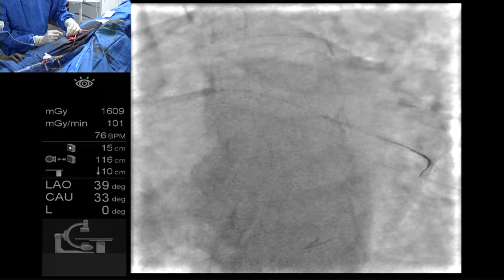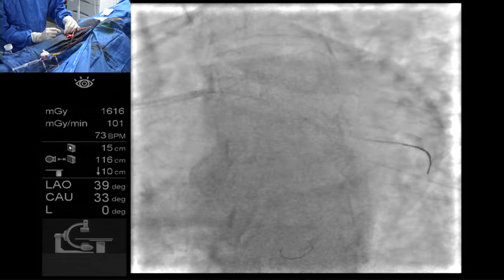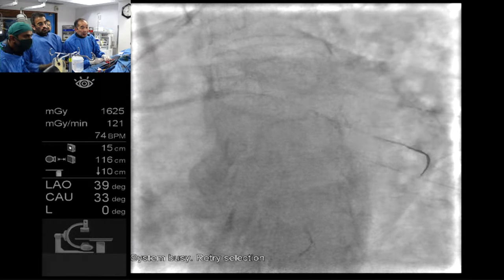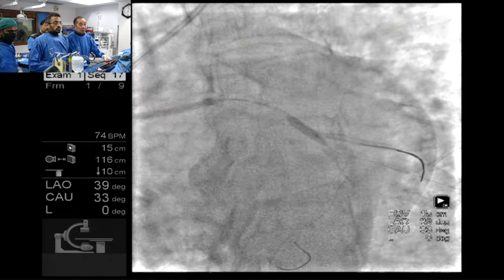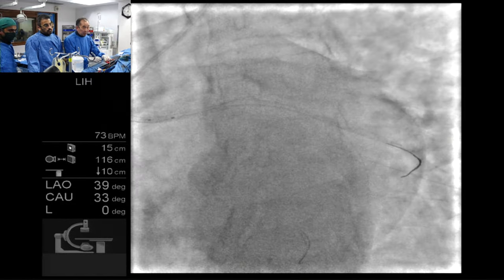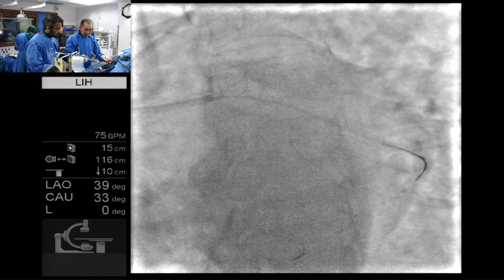Okay, can you just do here one more time? Go. High, 18. Done. Then I pull it back here. 18 here. Yep, I would do a nice part there. Here, right? Okay, good. Should be okay. Just look at that. All right, give me the 1.5 balloon again. Hook up to here. Yeah, hook up.